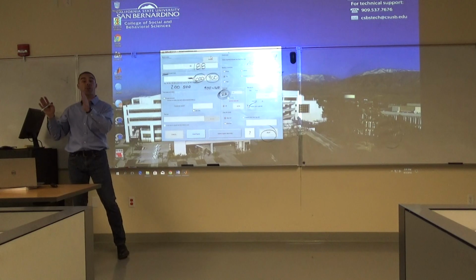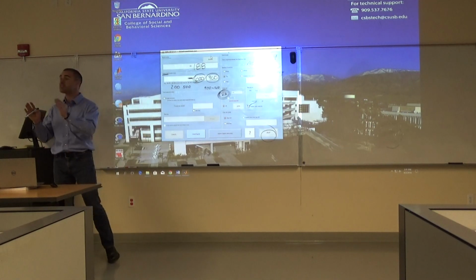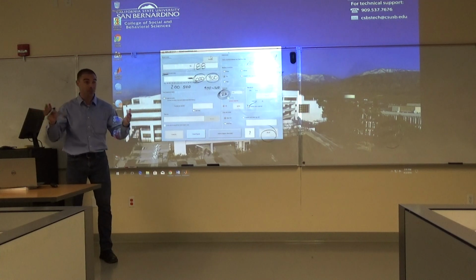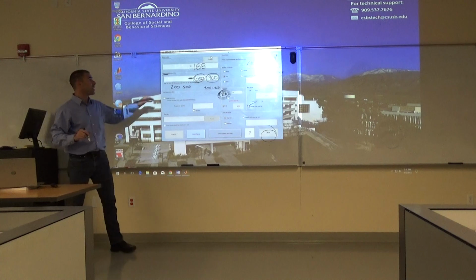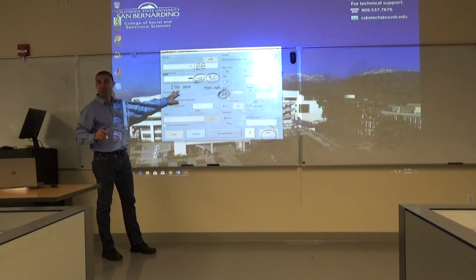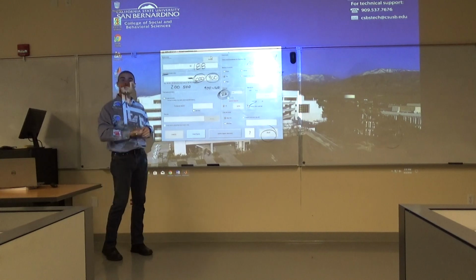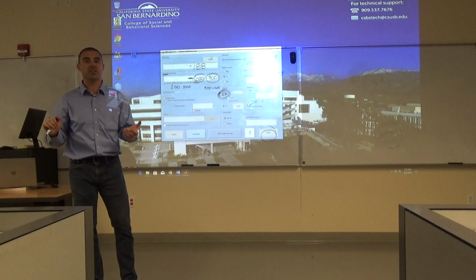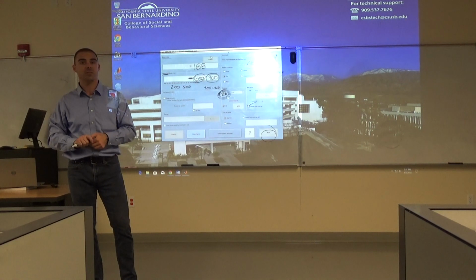You can see how the brain activity is different at different times, which you hope it is, right? Because if not, you're kind of brain dead. You want your brain to be changing at different times. So you can change the different times that you look at, and if you play around with it, you can see how the shape of the activity on the head is different. So why don't you try that for a little bit and see how that changes with time as you play with those parameters.